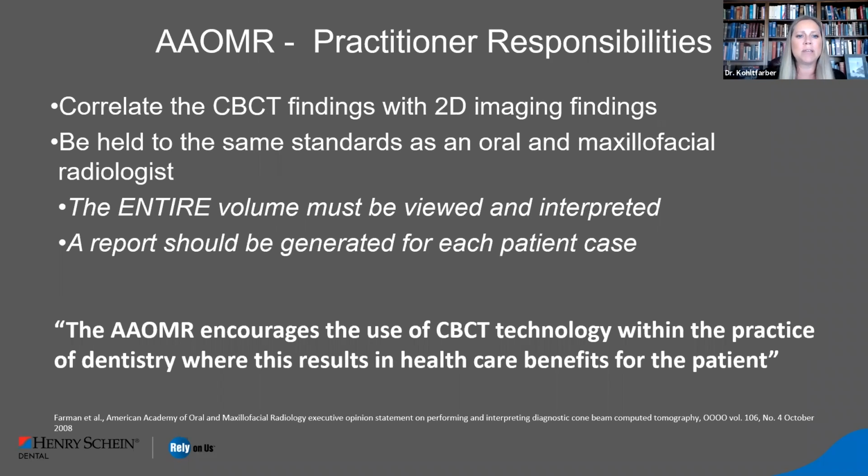It also states that we need to be able to correlate the CBCT findings with 2D imaging. Why might that be important? Well, actually, we can learn quite a bit from that. In fact, if you go back to your 2D, you might say, oh, wow, that's why I was seeing what looked like a lesion. So I think this is a great learning opportunity for us as well. It actually will enhance your diagnostic skills in 2D as well. It does also say be held to the same standards as an oral and maxillofacial radiologist.